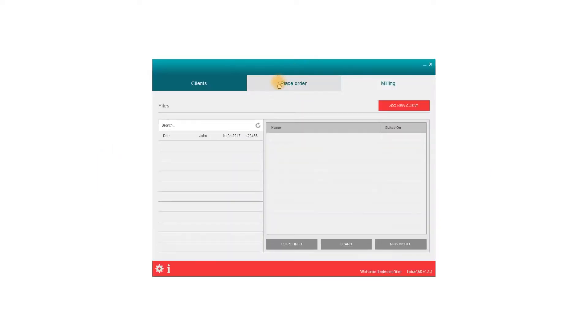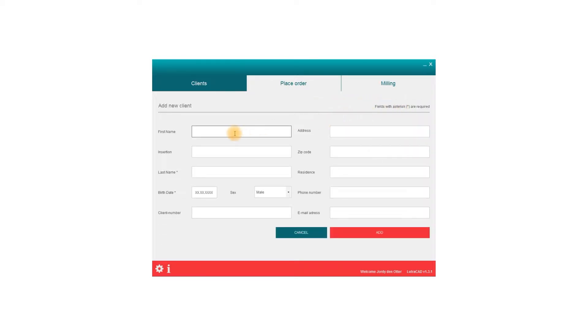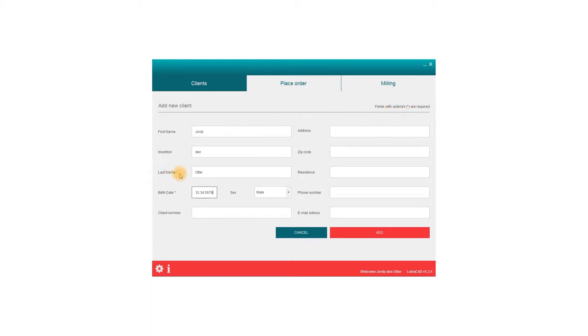To add a client, simply click the button Add New Client. Fill in the client's information. The minimum requirements to complete the form are their last name and birthdate.